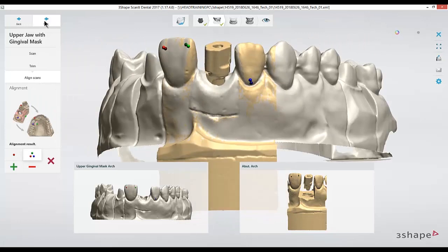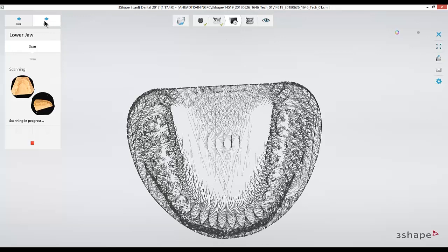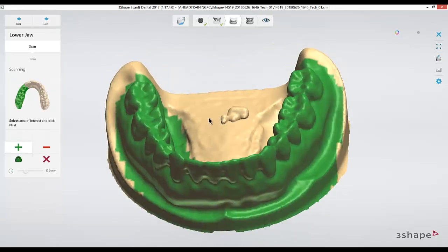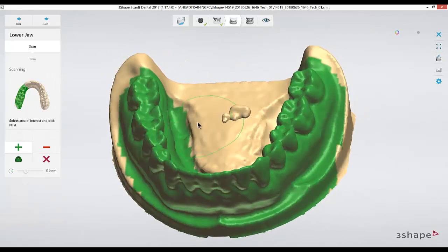After that, we'll continue and scan our opposing arch and our bite scan in the same manner that we would for standard crown and bridge cases. We'll scan in our lower arch, first a preview scan, and highlight the arch for the detail.